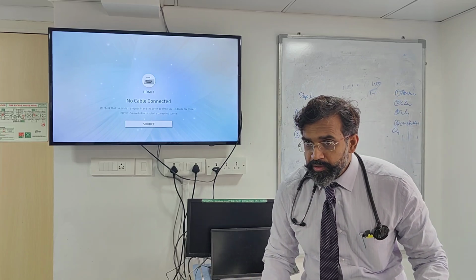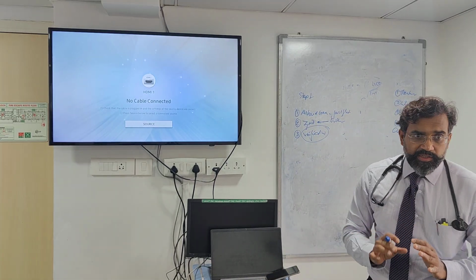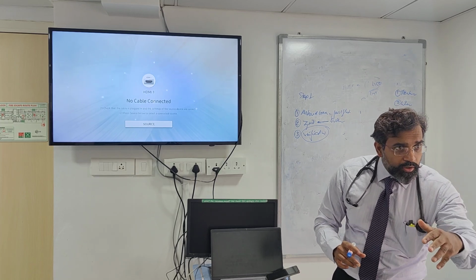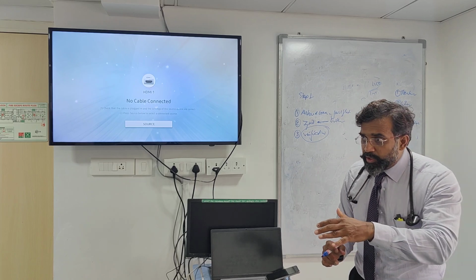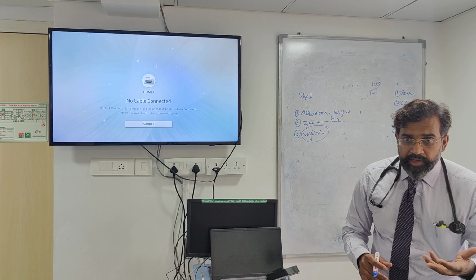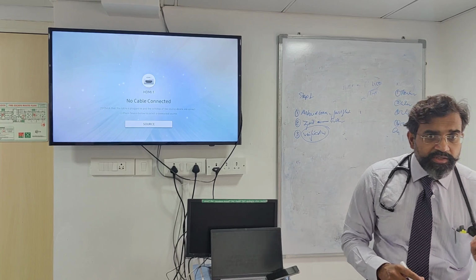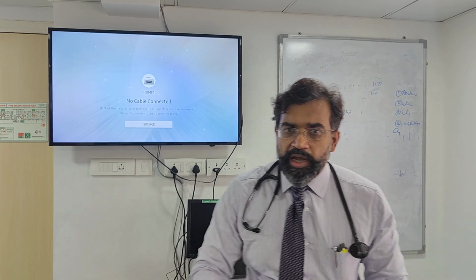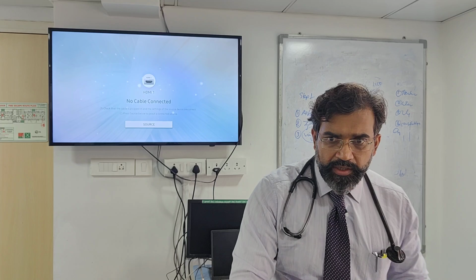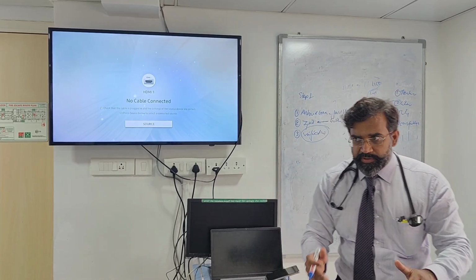Clear on this? So verification is about where that device is placed properly. It cannot be in the proximal tip. It cannot be where there is noradrenaline going on. It cannot be where the central line is being monitored. If there is, your alternative is to switch off everything. One mistake you can make is that you have flushed and you convert that to a 45-degree angle. Not to do that. When you are flushing, when you are giving the thermodilution, let's come to the procedure.